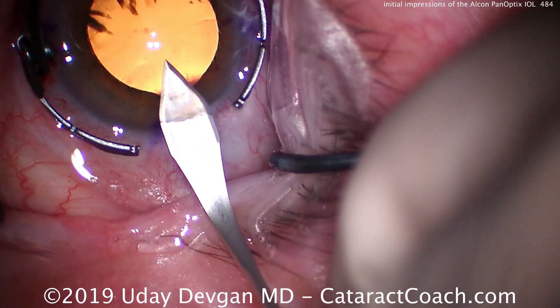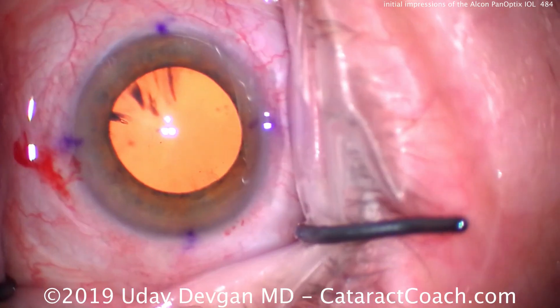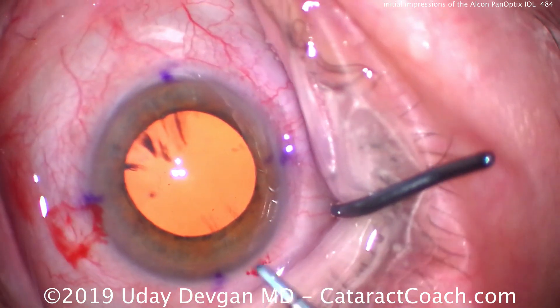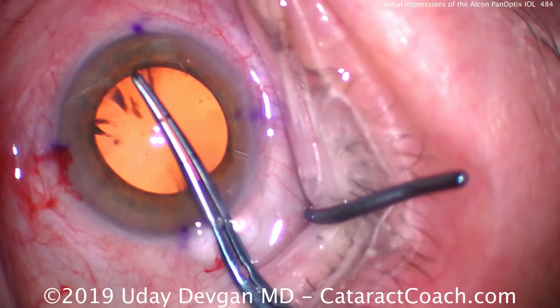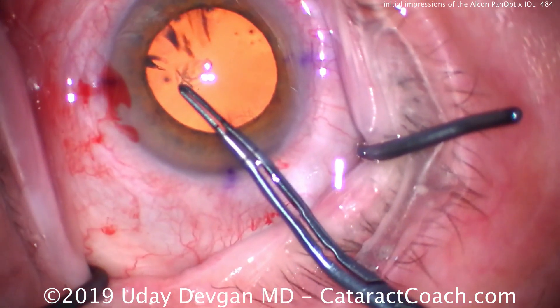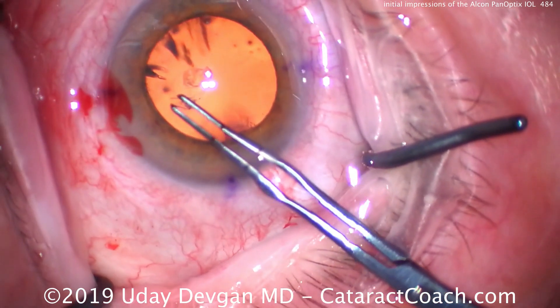We're making the phaco incision at about the 10 or 15 degree meridian. The steep axis has already been marked off with those little dots on the cornea, and that steep axis is at about 100 or 105 degrees. We're going to make our capsulorrhexis.